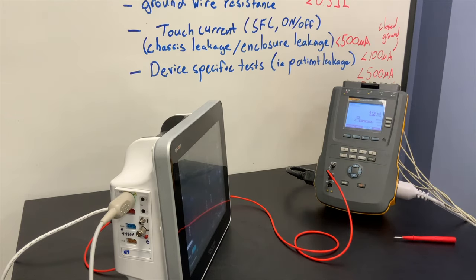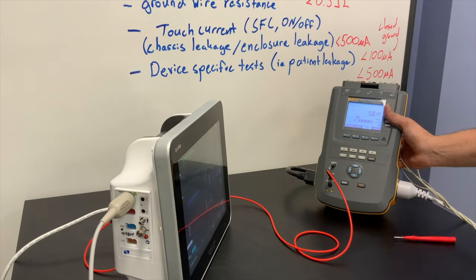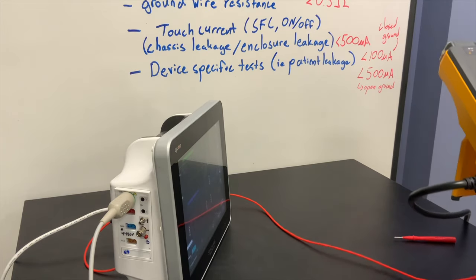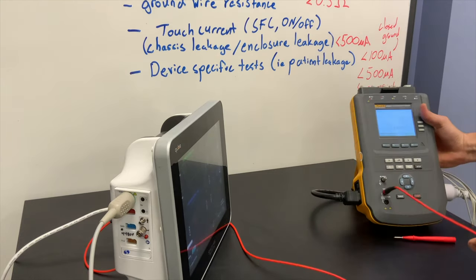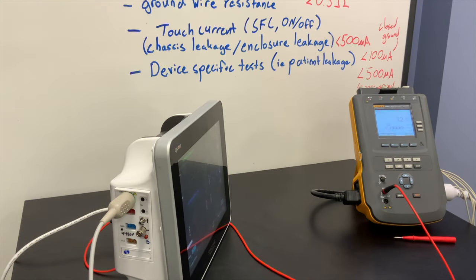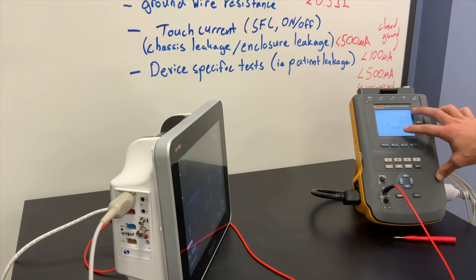And that's how you do patient leakage tests for a five-lead ECG on the Fluke ESA-612. A couple other nice things about this tester: you can do point-to-point tests, which basically means you just bought a $3,000 to $5,000 multimeter. I very rarely see instances where those point-to-point tests are used, but it is an option.